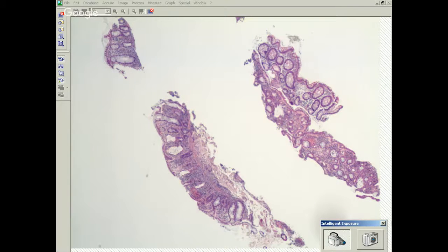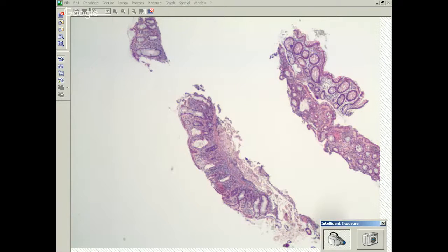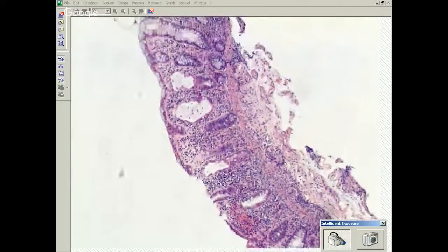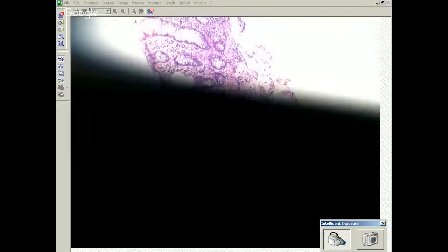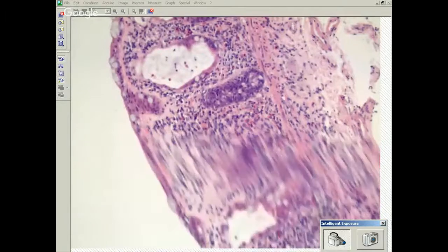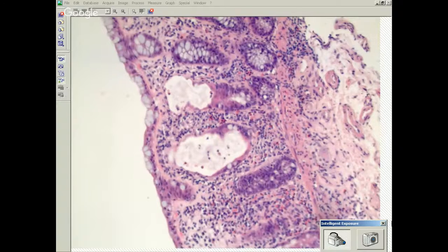Okay. All right. How would you describe this colon? Well, the architectural profile is very busy. Okay, so there are some chronic changes. There's some gland dilation. Okay. Yeah, the lamina propria is full of inflammatory cells. Yeah, it's chronic. Okay.